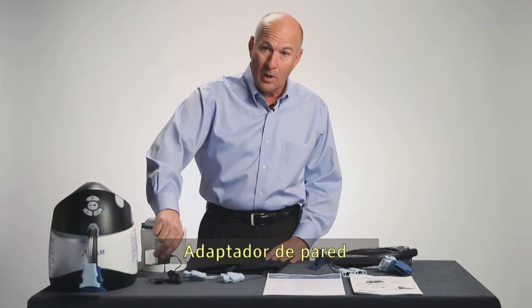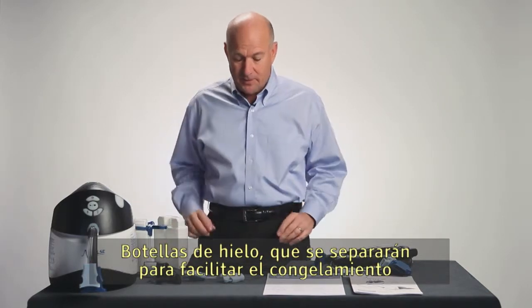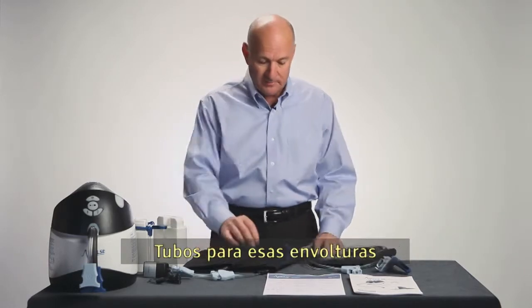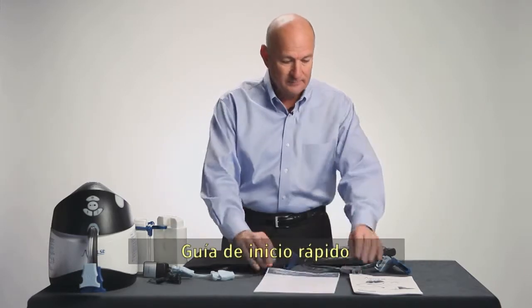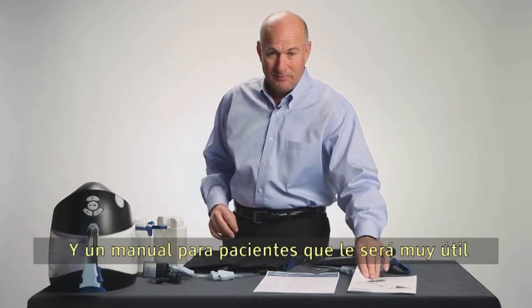These are the components that come with your V-Pulse system: the control unit, wall adapter, ice bottles that separate for ease of freezing, calf wraps, tubing for those wraps, quick start guide, and the patient's manual. You'll want to hang on to this — it's going to be very helpful.